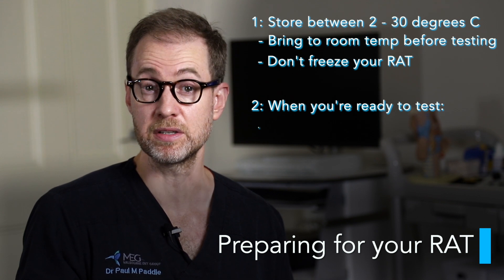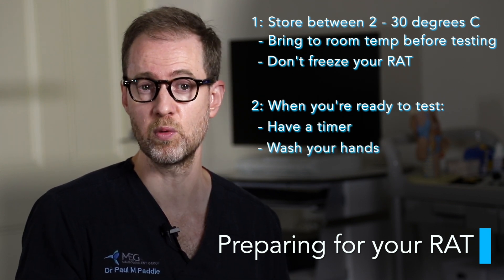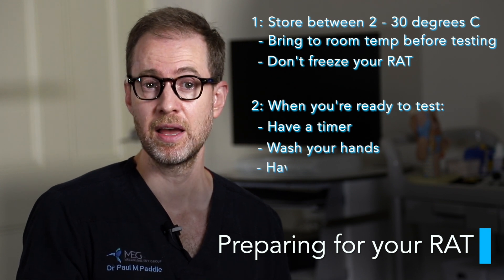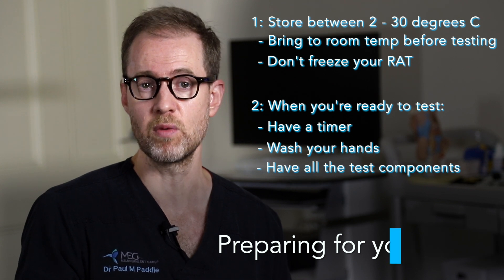When you're ready to test, have a timer ready such as on your phone or watch, wash your hands with soap and water for at least 20 seconds or use hand sanitiser, and make sure you have all the test components laid out in front of you and ready to use.